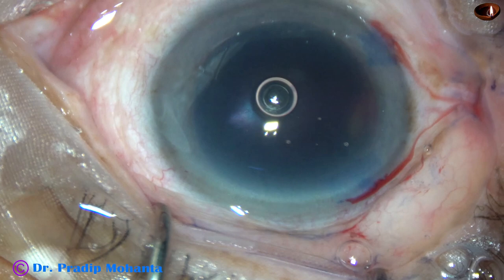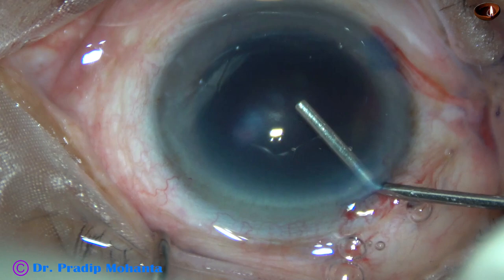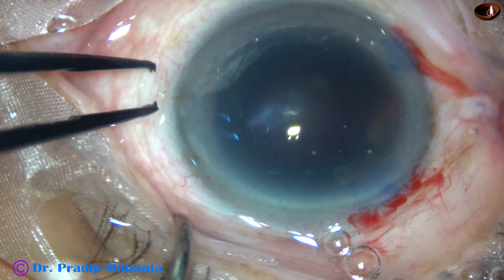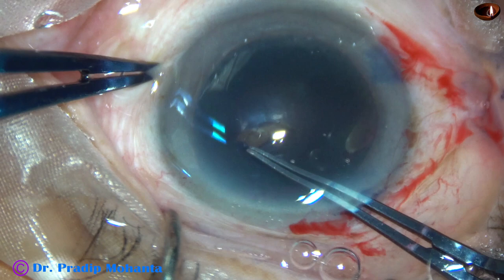Now the anterior chamber is filled up with 2% hydroxypropylmethylcellulose. Even for this black cataract, I am going to use only this visco, because my technique is application of ultrasonic energy within the substance of the nucleus.